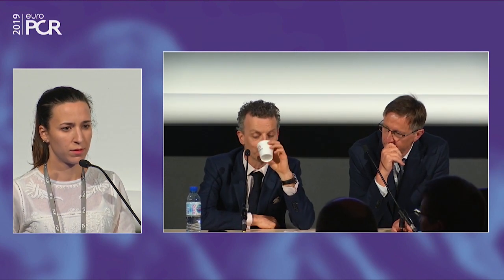So once again, we open up questions to the audience. Jonathan: with the crossing of the first balloon? Yes. No, we went to the rotational atherectomy because we have more experience with that at this moment. But I think this insight has changed because of the good result with the intravascular lithotripsy. So yes, more for our experience in our center. It's our first technique when there is bulky calcium. Other comments? What was the size of the burr you used? 1.2 and then 1.5 millimeters.